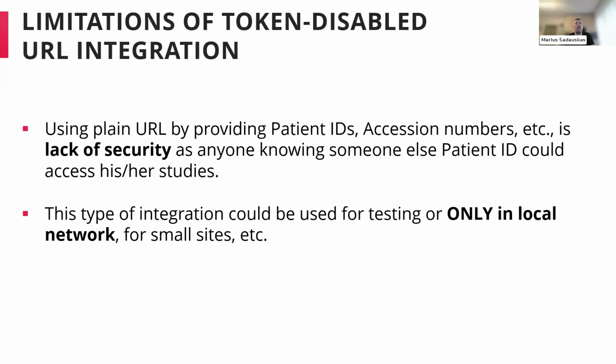Yes, before going to the installation and configuration part, one more thing to stress about this token disabled URL integration. It lacks security, because if you provide this open, token disabled integration by study ID, patient ID, accession number, and so on, anyone knowing this information would be able to access other persons' studies.